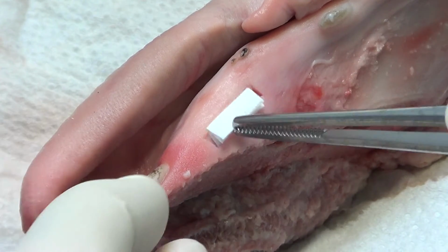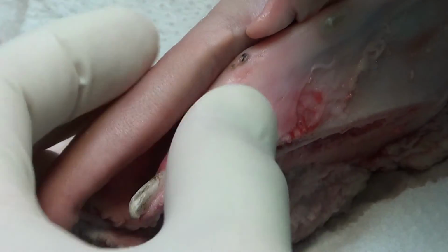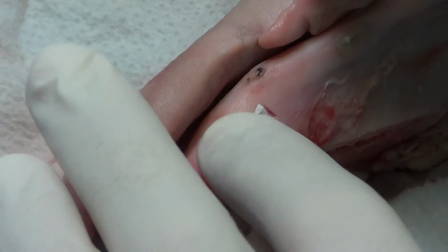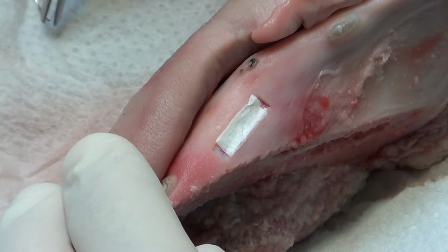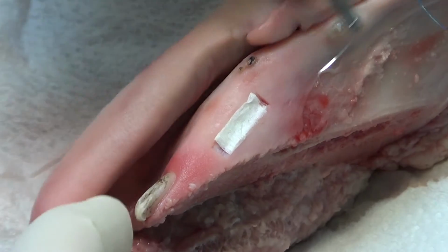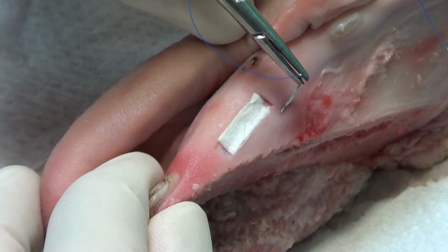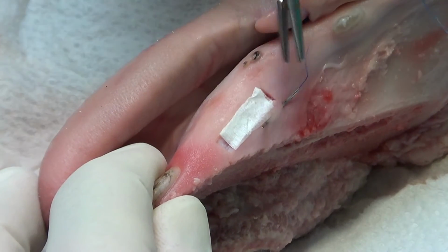So we put the sponge. The sponge starts to be covered by the blood. Fortunately, the pig is not bleeding. Then we start distally, at the end of our wound. We exit 3-4 millimeters mesially.